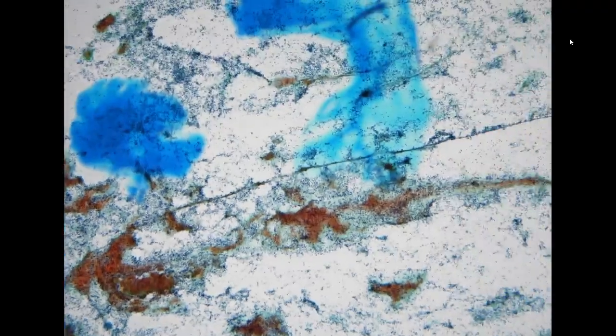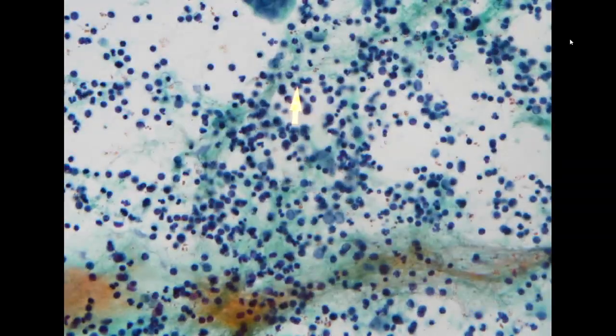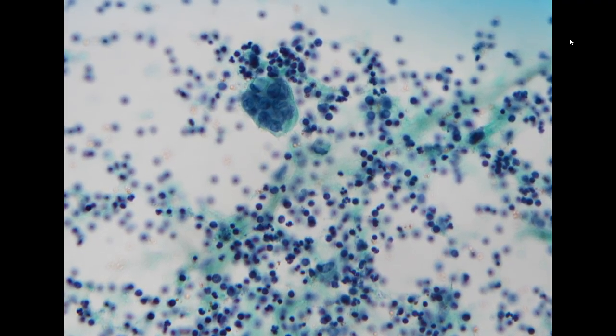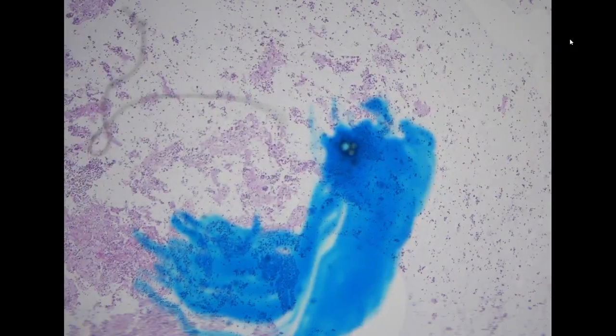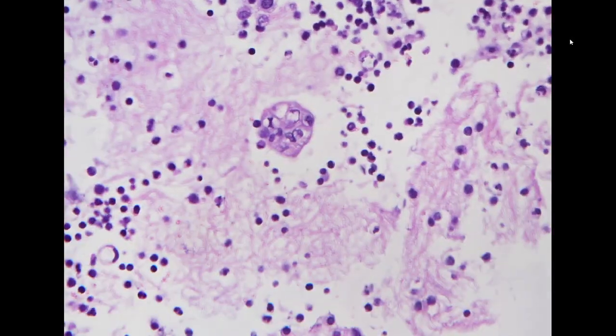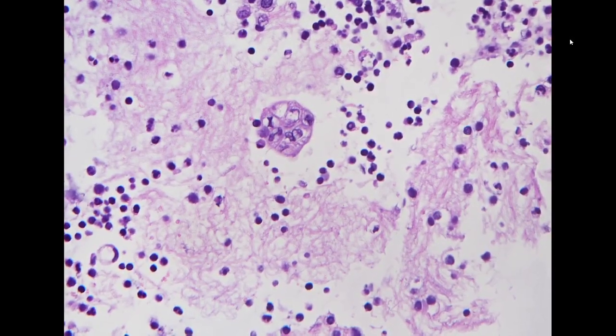So this is from the same patient. She had two different specimens. This is also very typical, and you have more nuclear atypia and pleomorphism over here. If we take a look at the cell block preparation, it is also easy for us to identify very similar clusters of metastatic tumor cells.